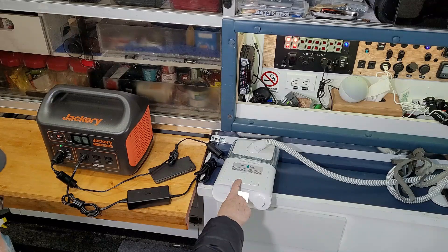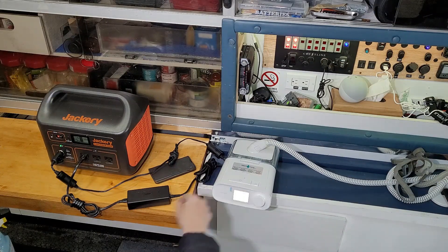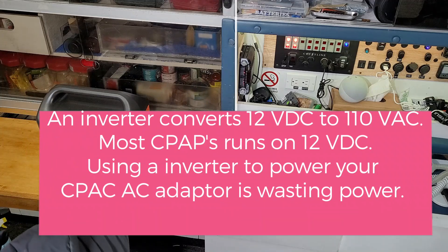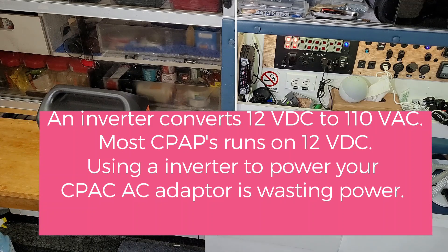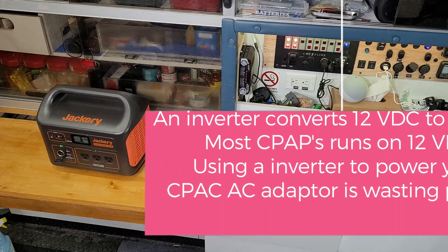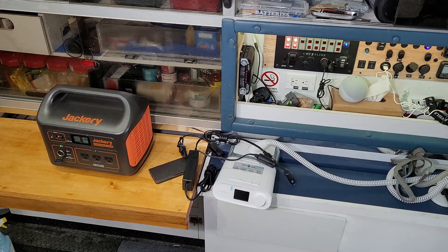Using the inverter, it converts 12 volts to 110 volts AC. Most CPAPs run on 12 volts, so using the inverter to convert your power from the CPAP to an AC adapter is actually wasting power. I hope you'll learn a little bit of something from this.